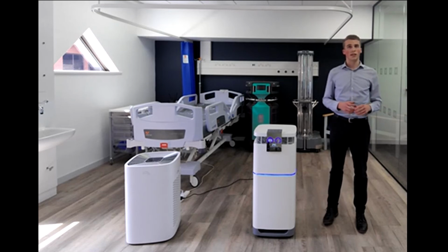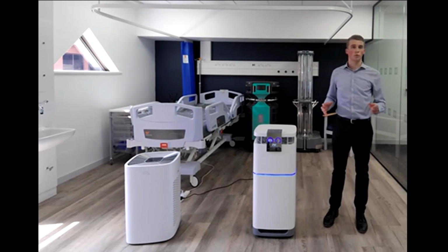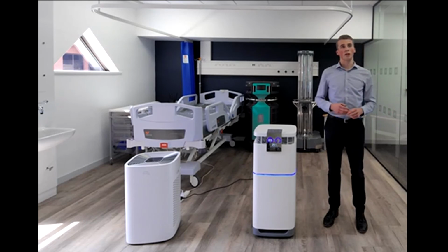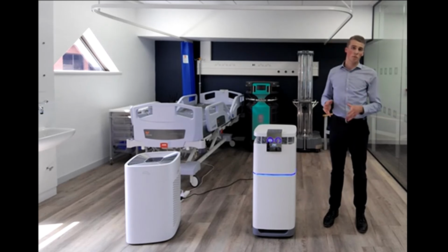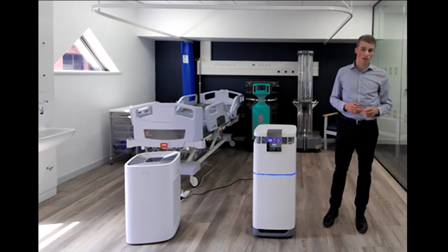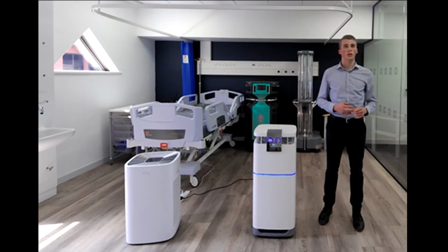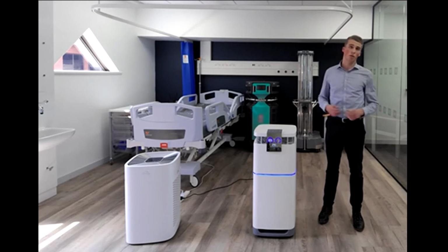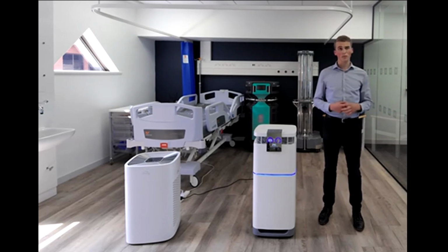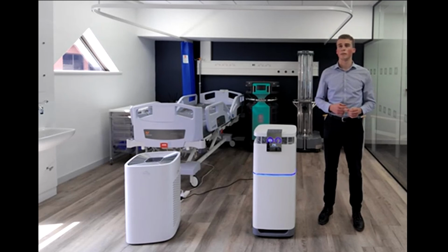However, essentially, we're looking for areas in the room where the system can be placed and it's not going to obstruct the movement in that area. So it needs to be out of the main walkways and the key areas where there'll be movement and equipment placed, but we also want to ensure that they're evenly placed around the room to maximise the chance for that full airflow around the environment. Obviously, they are mobile systems, so we can be flexible in our approach when we're deploying them.